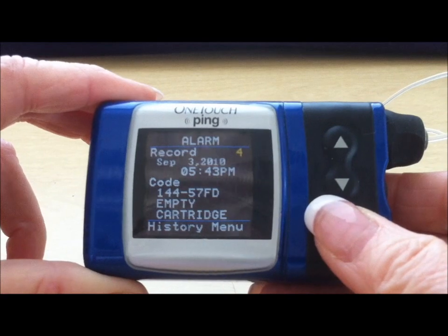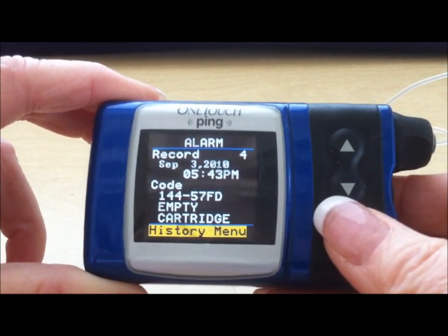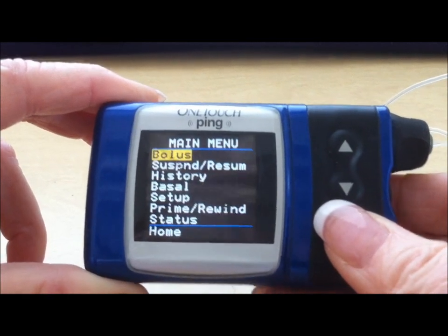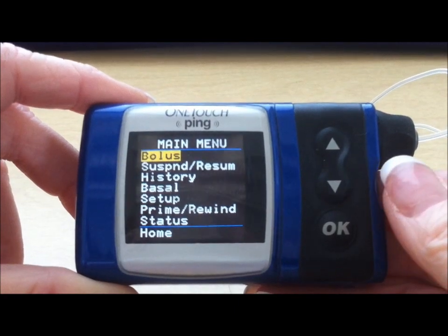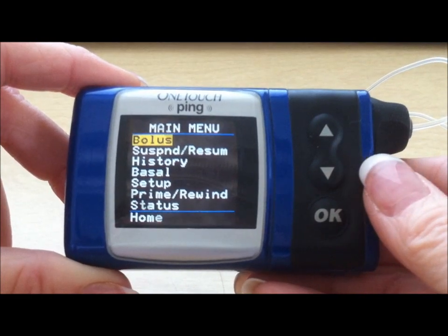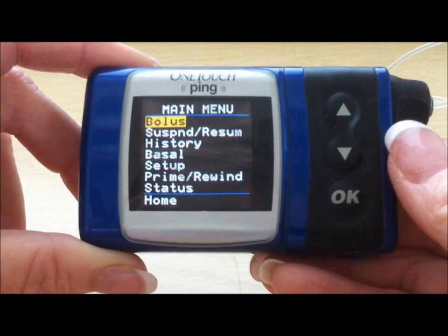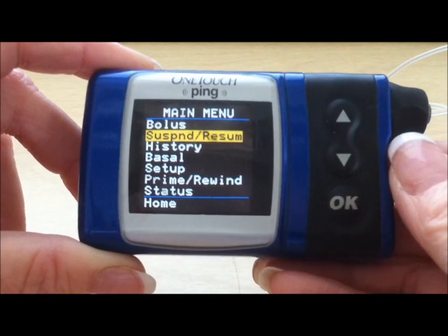To exit out of the history menu, press Enter — it goes to the history menu. Enter again, then scroll down to the main menu. Another important thing to know is how to stop and start the pump. The pumps are smart pumps, so if you're in a go mode the only option is to stop it; if you're in a stop mode the only option is to make it go again. Scroll down from your main menu down one to suspend resume.